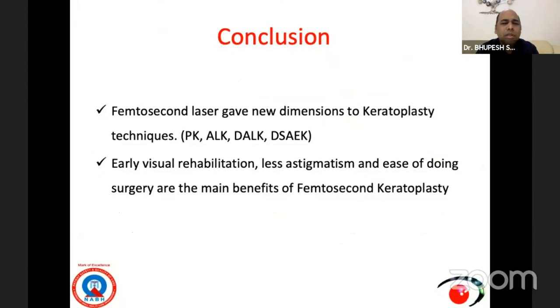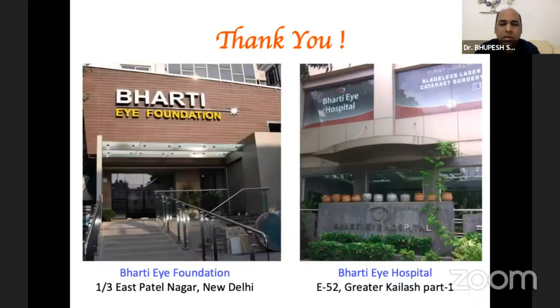So in conclusion, the femtosecond laser gave new dimension to keratoplasty techniques, from PK, ALK, DALK to DSAEK. In all the surgeries, it has its role, and the early visual rehabilitation, less astigmatism, and ease of doing surgery are the main benefits of femtosecond keratoplasty. Thank you.